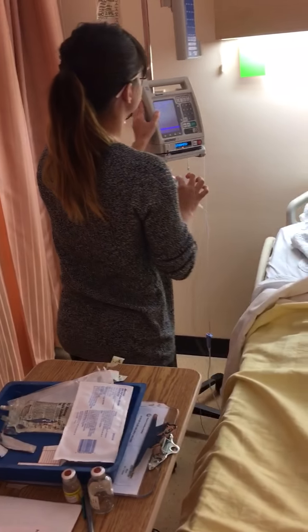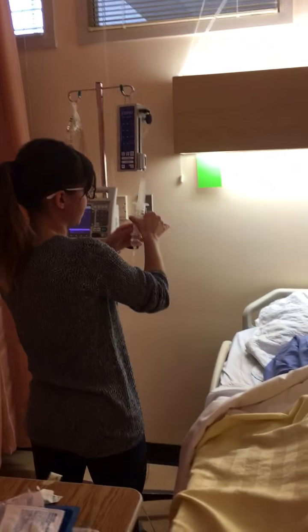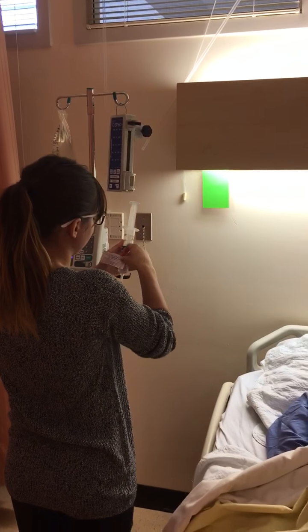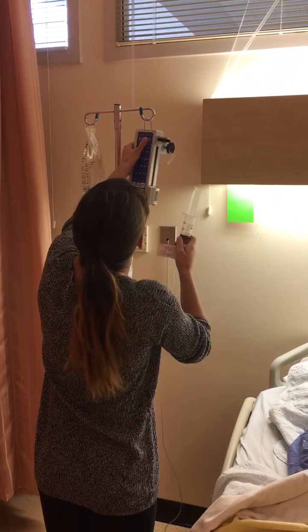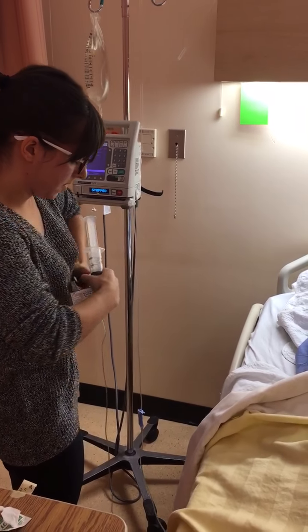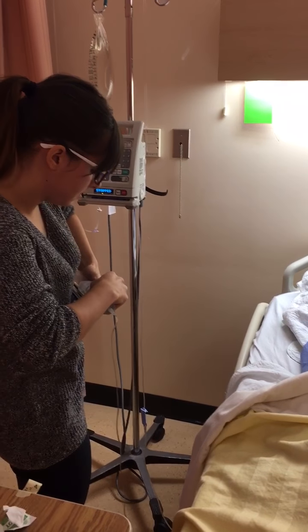And then I'm going to be doing it via the CIVA pump. So I'm just going to adjust this here. Okay, perfect. And we need to insert this like this.